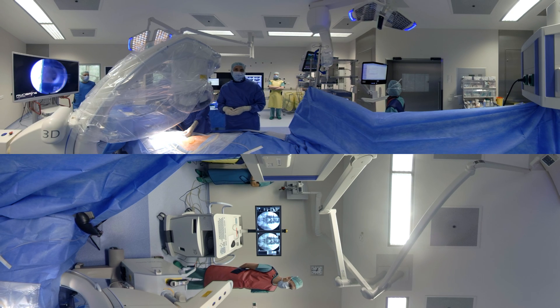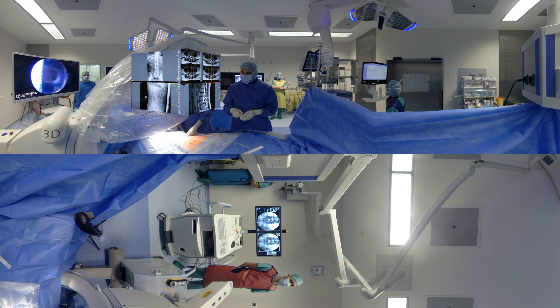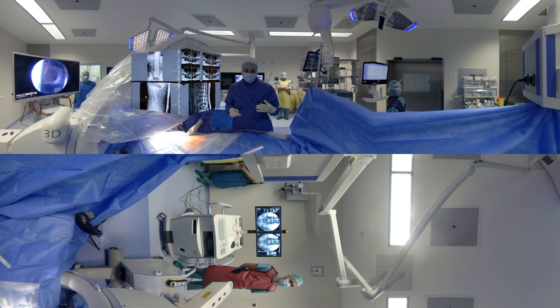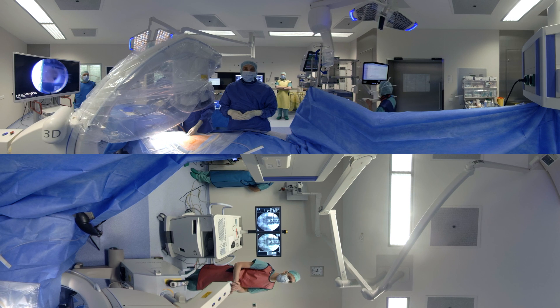Hello and welcome to our operating theatre. We will be demonstrating a case of a discectomy at the level L4-5. This is a fairly young patient who has had acute onset of symptoms, L5 on the left side. If you look at the images, he's got a very large disc herniation, L4-5 on the left. The goal is now to decompress the neural structures and do a discectomy.